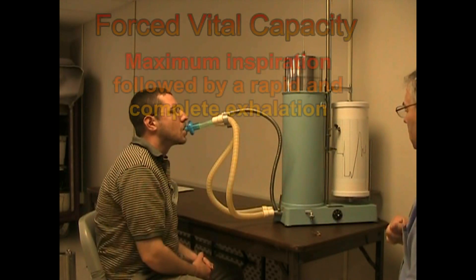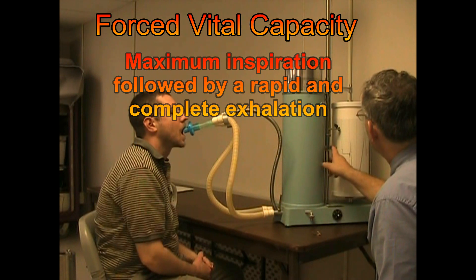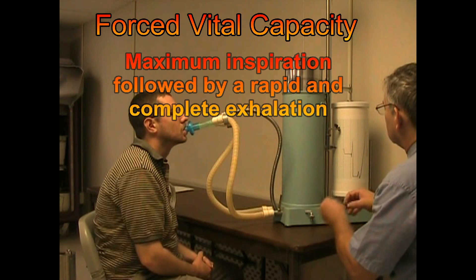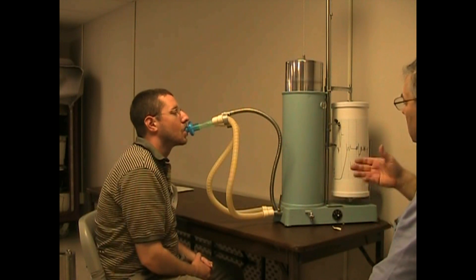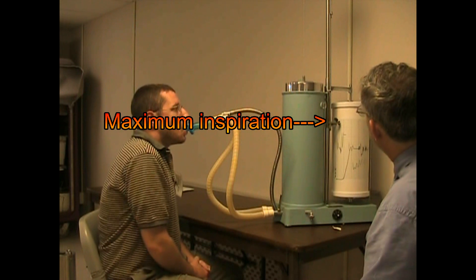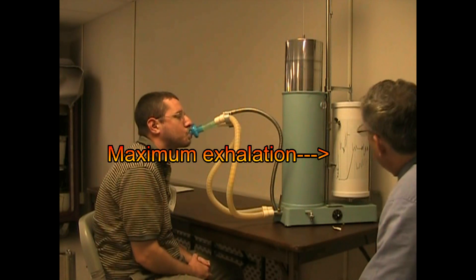This time I'm going to have you take in a deep breath in and blow it out real fast. Normal, easy breathing. Big breath in — second deep. Fast — blow, blow, blow. Keep blowing, keep blowing, squeeze it out. Okay, normal breathing. Good.